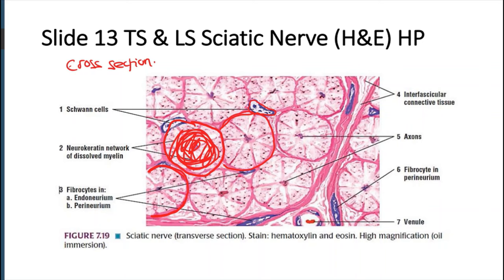All right. So now, this connective tissue that is surrounding a fascicle, which is just a collection of individual nerve fibers, this is the perineurium. So draw the perineurium like this, and then include all these individual nerve fibers inside, labeling even the endoneurium. Show the nucleus for the Schwann cells. So draw this at high power.